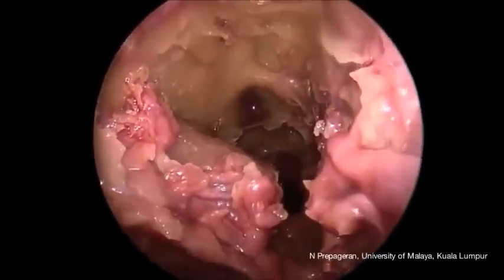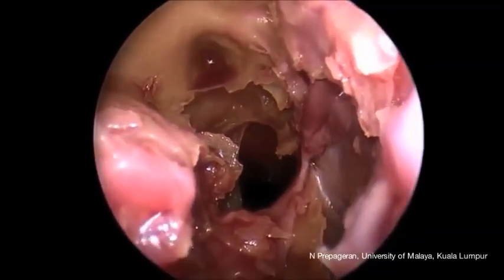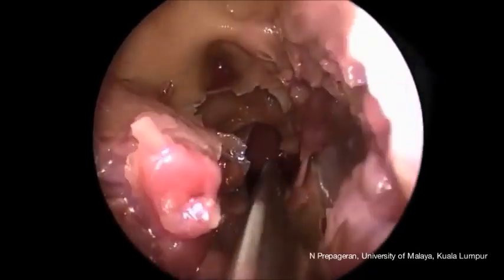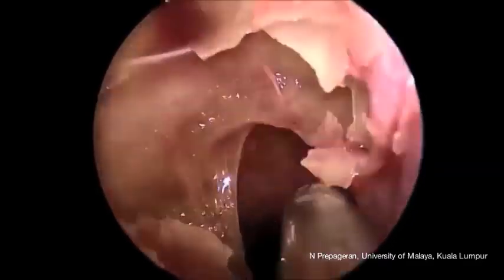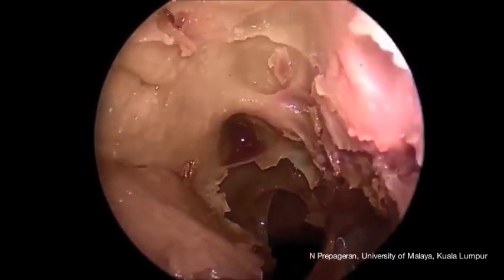Let me remove a bit more mucosa. There you go. Very nice view of a trans-ethmoidal view into the sphenoid sinus itself. Let me suck the sphenoid sinus, and again, you can very nicely visualize the pituitary gland in the sphenoid sinus itself, thus confirming it is the sphenoid sinus.